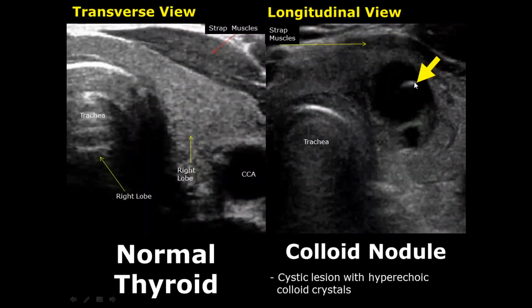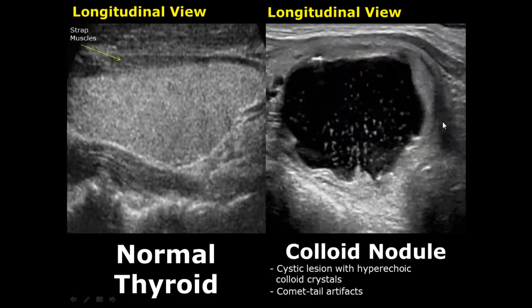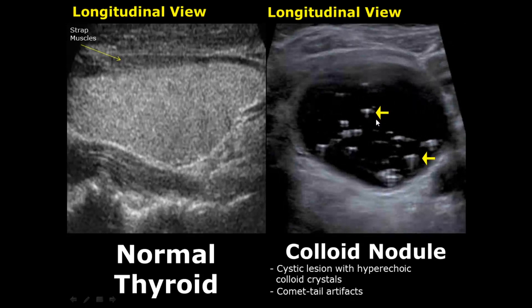A colloid nodule will have a cystic lesion filled with echogenic colloid crystals. Here you can see one crystal in this image — it is hyperechoic. Here is another image of a colloid nodule having multiple colloid crystals that are hyperechoic. They can also have comet tail artifacts, which you can see more clearly in this image. Usually these types of cystic appearances or appearances with internal septations are benign.